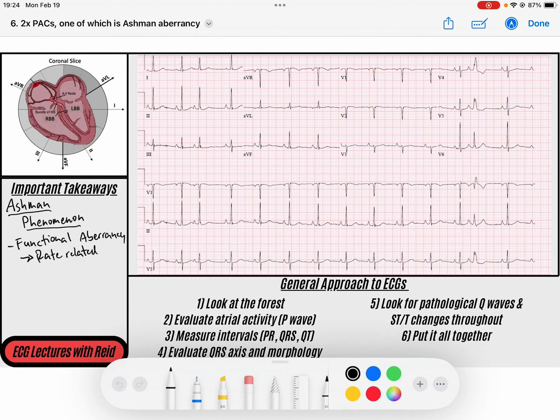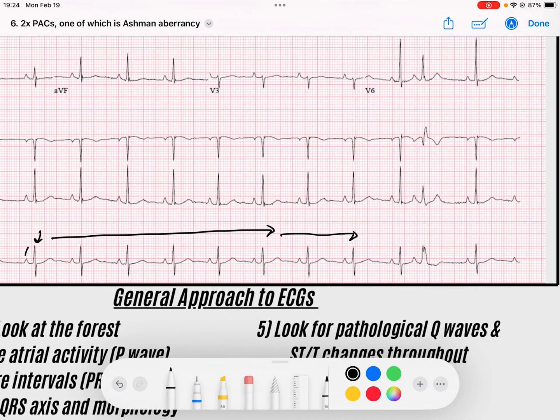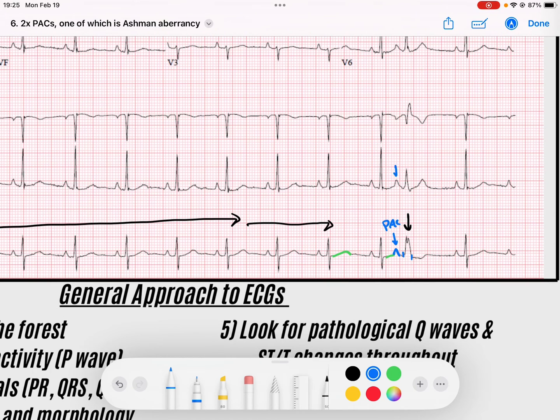Let's take a look at some strips. Here, notice we've got a sinus rhythm — P waves conducting to QRS complexes, pretty regular. And then notice we get a premature contraction: it's early and it's wide. You might think it's a premature ventricular contraction because it's wide. But then I look in front of it for a P wave. Comparing the T wave of the previous beat to the T wave of this beat — look at that sharp deflection. That's a P wave. That's a premature atrial contraction. You can see it landing there, looking very different from the previous T wave, and that P wave conducts to this wide complex beat.